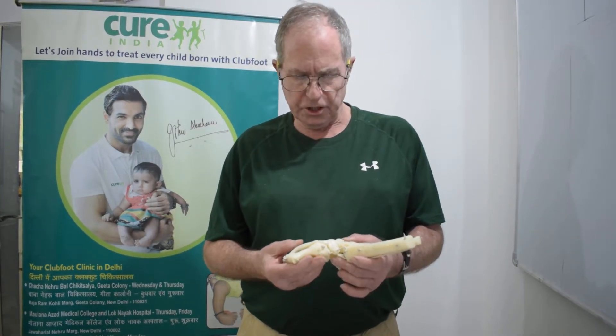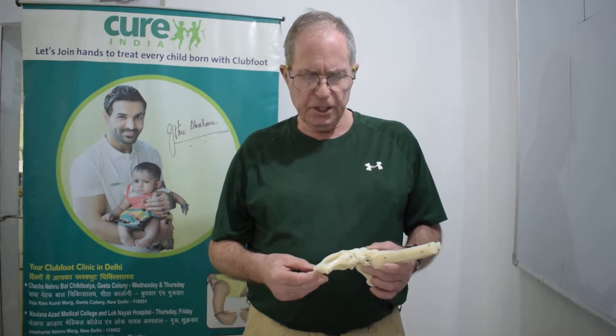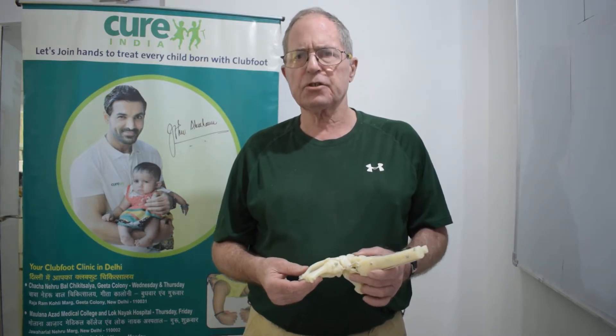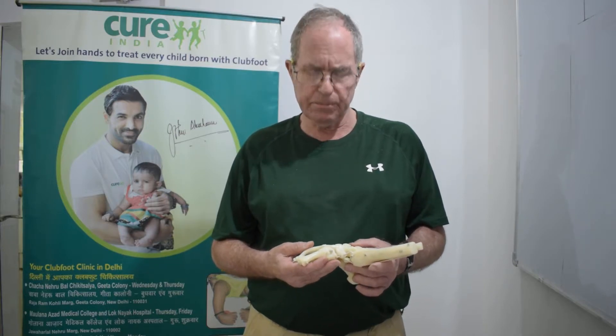Hello, this is the sixth in a series of videos on the subject of clubfoot and clubfoot correction. In the first videos we discussed techniques of manipulating and casting, and we also discussed record keeping and the importance of record keeping and tracking the effectiveness of treatment.